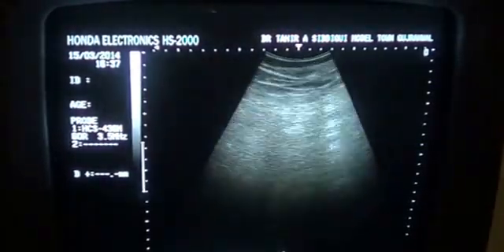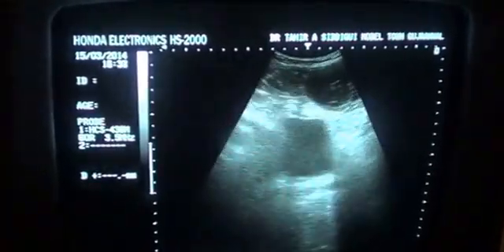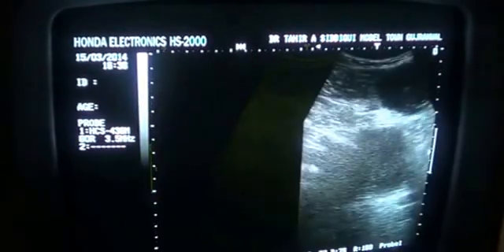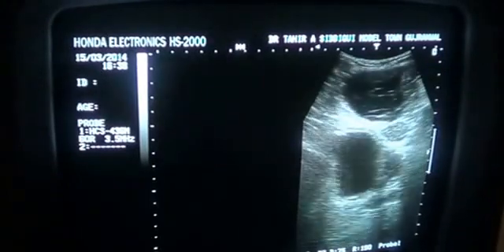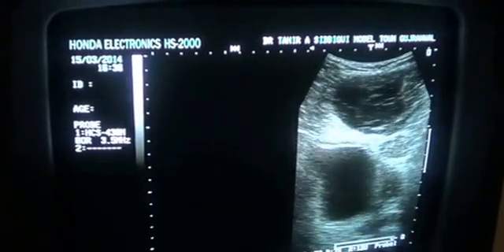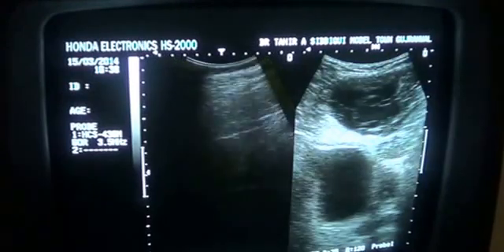Yes. So coming back to the primary pathology, this is a case of subcutaneous collection, that is an abscess in the mentioned location, with right obstructive uropathy.